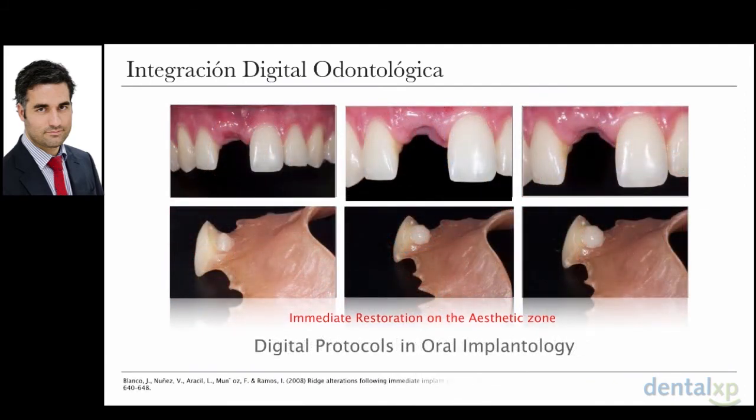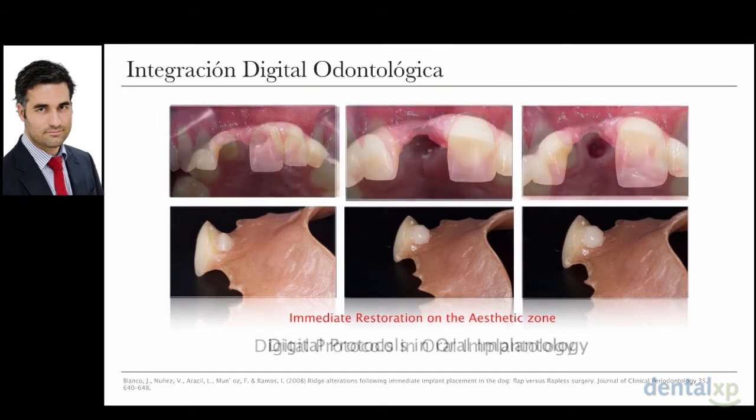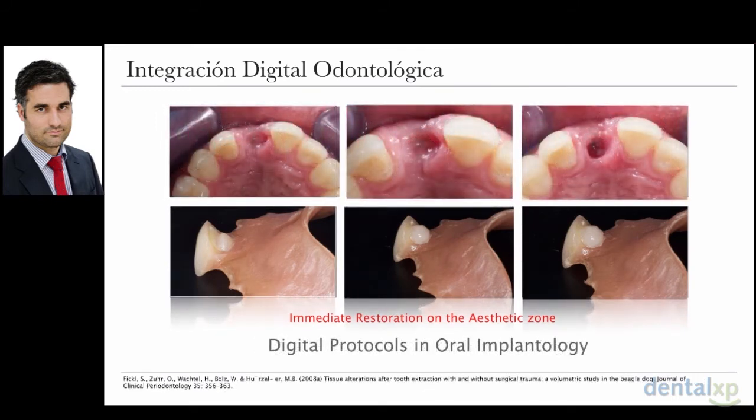Implant placement, and something that I've been using in my dental office is that I don't do a two-stage surgery. If I place the implant and leave it completely covered, I don't do a second surgery. I use the removable prosthesis from the patient, and I apply acrylic until I get a perforation in the soft tissue, and I expose the implant shoulder, and I can remove the screw.